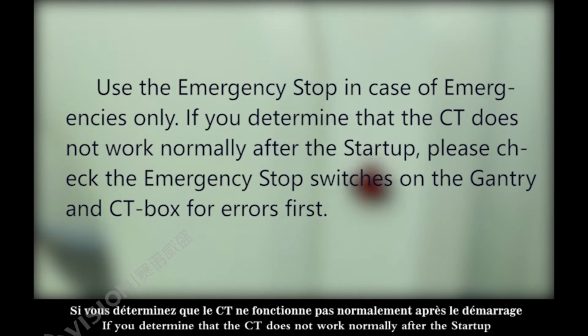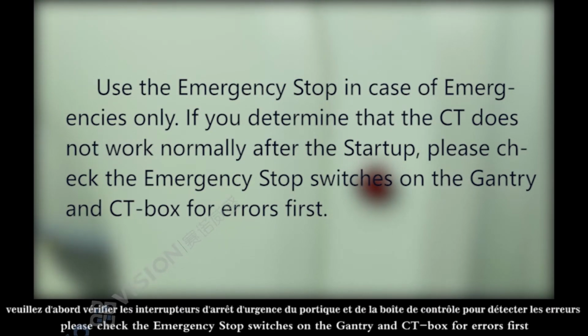If you determine that the CT does not work normally after the startup, please check the emergency stop switches on the gantry and CT box for errors first.